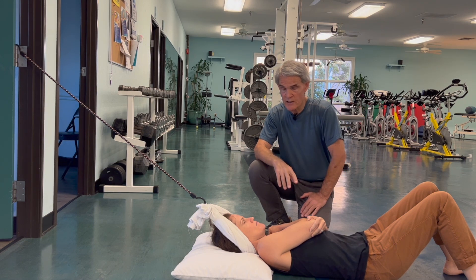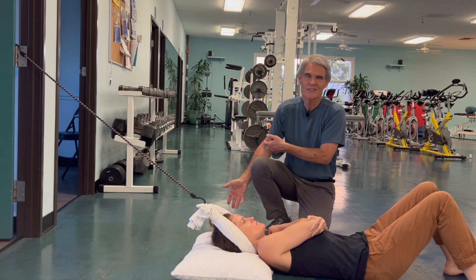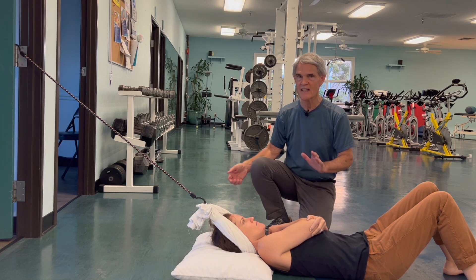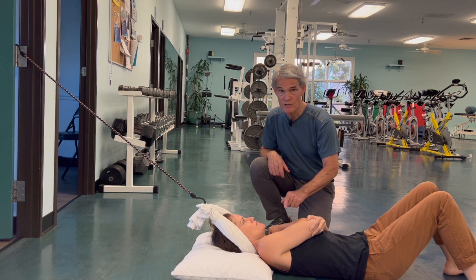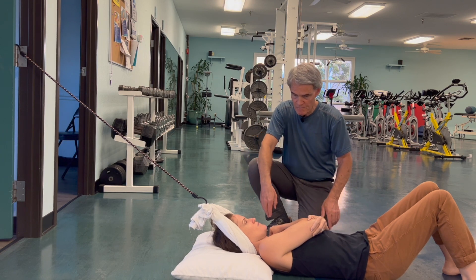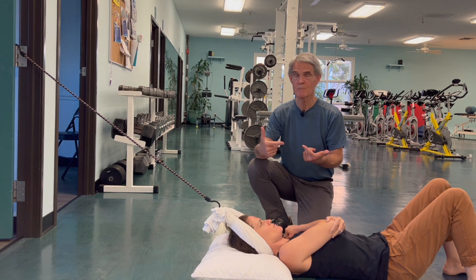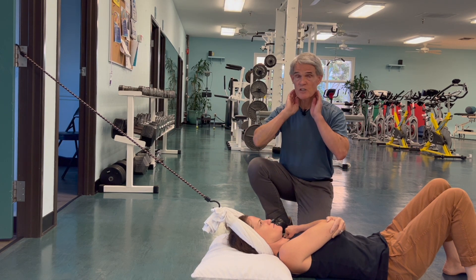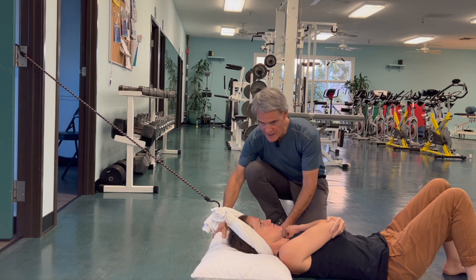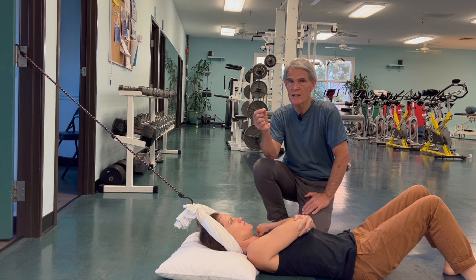When the neck is bad enough and the nerves are irritated into the arm, you may need to get into this position. If having your arm by your side causes a pulling or an ache in the arm, you have to eliminate that by slackening the nervous system. If the amount of pull is not enough, she can simply slide towards her feet and the bungee cord will apply more decompressive force. If the traction feels excessive, she can slide towards the door to reduce it, giving complete control over the magnitude of the decompressive force.